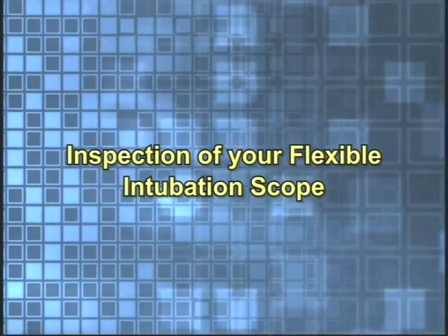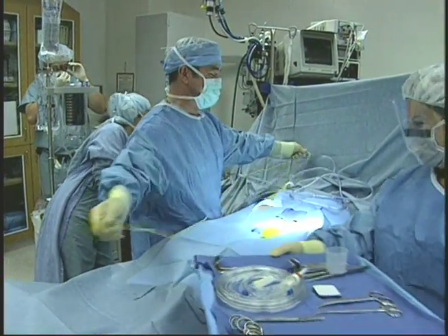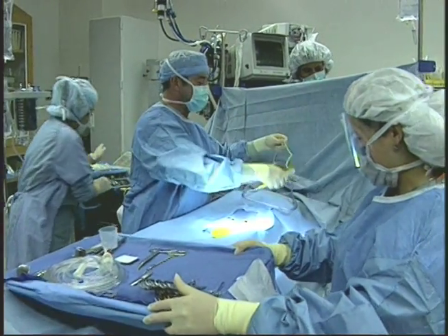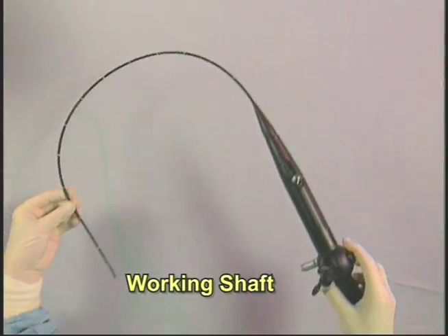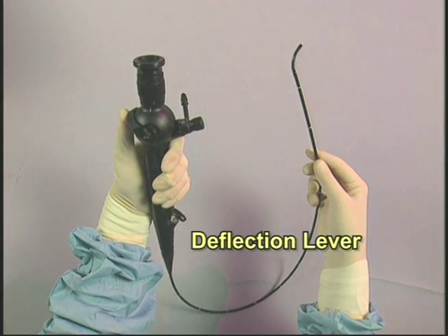Inspection of your flexible intubation scope. Every Karl Stortz flexible intubation scope must be thoroughly inspected prior to each procedure. The following parts require inspection: the working shaft, the objective lens, and the deflection lever.